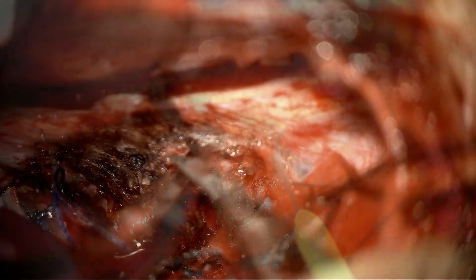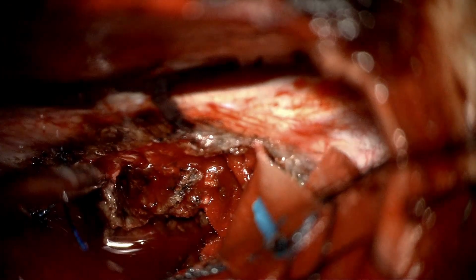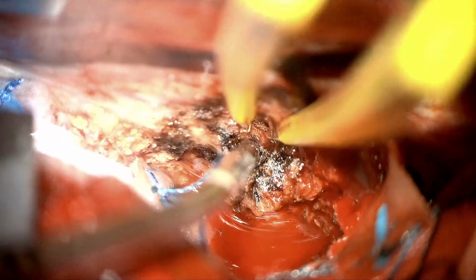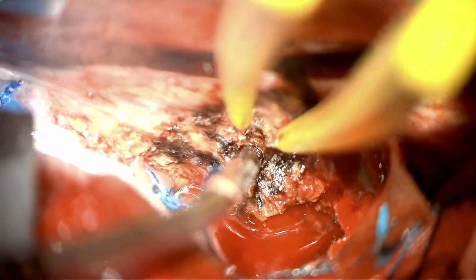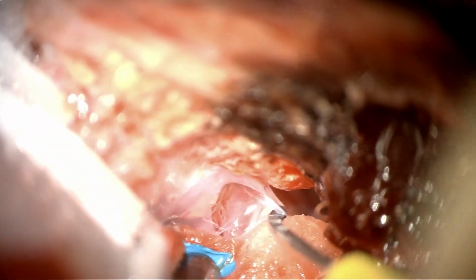First is devascularization. Even after aggressive devascularization, there is always some venous bleeding from the cavity between both dural leaflets of the tentorium at the level of the edge. Once the tentorium is divided, we use sharp dissection to find the posterior aspect of the tumor behind the quadrigeminal cistern.